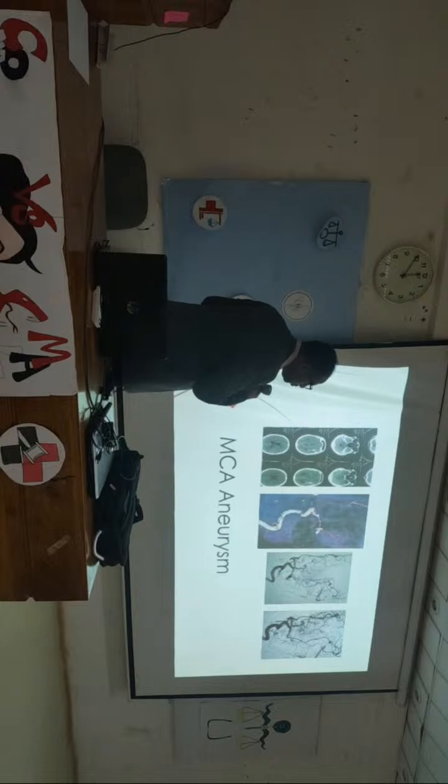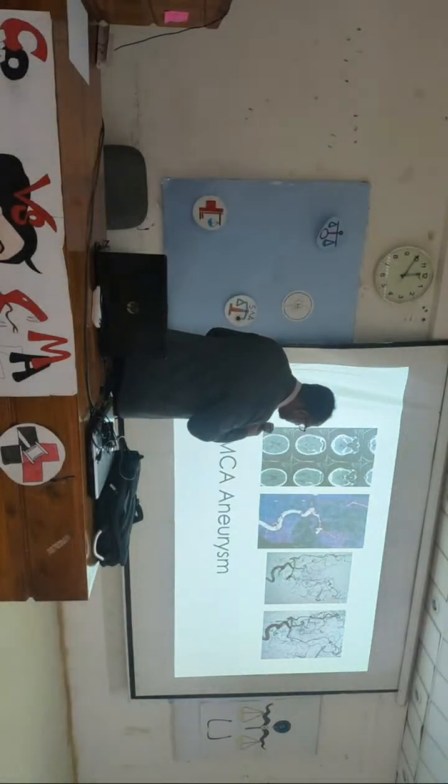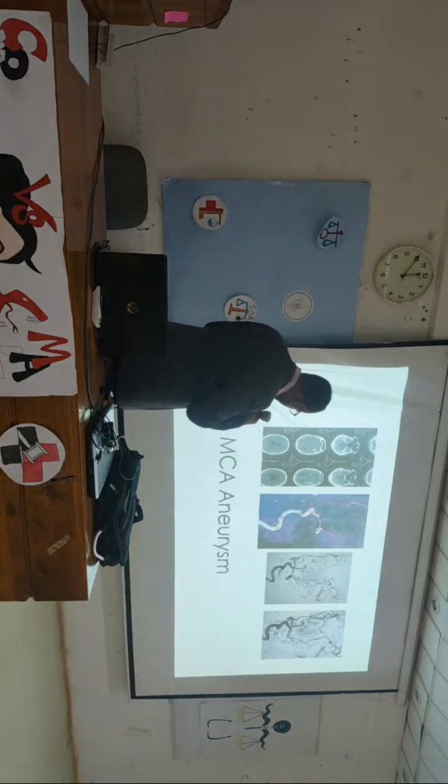If you do not occlude this part of the aneurysm, rebleeding will occur and 80% of patients will die if you do not secure this aneurysm. So here we go, and here we secure the aneurysm. These are hyperdense, bright white coils put inside the aneurysm, and total occlusion is obtained, isolating it from the circulation, and then preventing the patient from developing rebleeding.